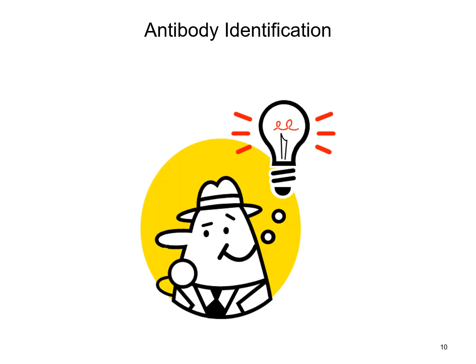Okay, so you've done your antibody screen and it's positive. What next? Well, we have to figure out what that antibody is. If our antibody screen's negative, our history's good, there's no history of antibodies anywhere, or any other complications, then we know that we're good to go. We don't need to do an antibody workup, but in some cases we might have to do an antibody identification.